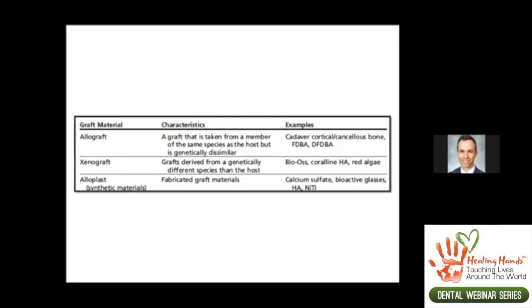I prefer mineralized, freeze-dried bone allograft personally, since it tends to have greater dimensional stability for holding the space. And sometimes I use a layer technique of combining allograft and xenograft. Allograft is replaced at a faster rate than xenograft and is incorporated into the surrounding bone at a faster rate. Xenograft is going to be typically bovine bone, but xenograft has excellent space maintenance capabilities, and it doesn't get resorbed as quickly and can hold the volume and thickness of the ridge that you've built.